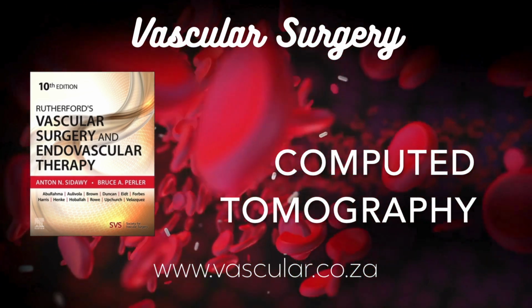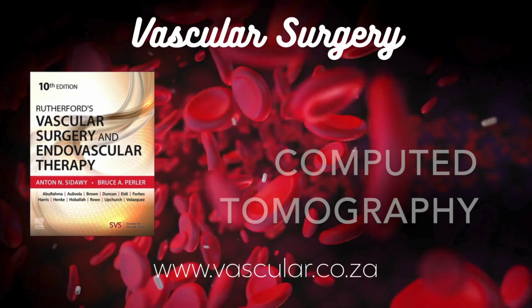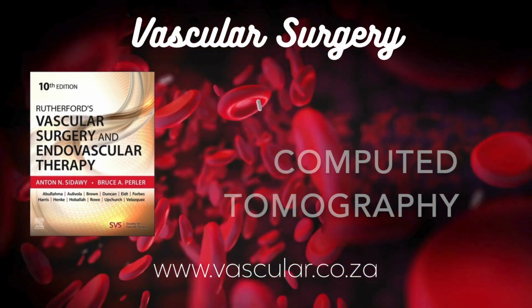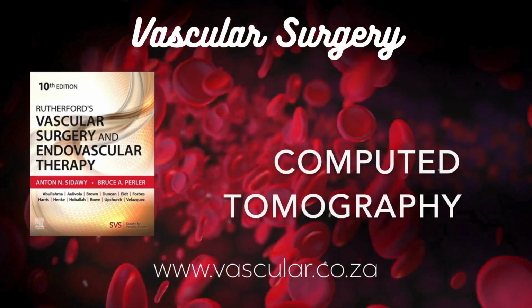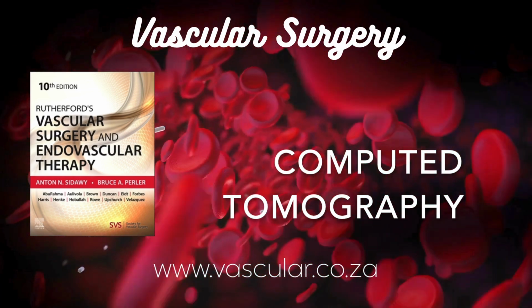Okay, let's break down a couple of those. KVP and MAs again. Remind us. Sure. KVP, kilovolts peak, sets the energy or penetrating power of the X-ray beam. Higher KVP penetrates better, which you need for larger patients, but it can slightly reduce the contrast between different soft tissues. Lower KVP doesn't penetrate as well, but it actually increases tissue contrast and, as we said, makes iodine pop more. So you might use lower KVP for smaller patients or specific CTA applications.